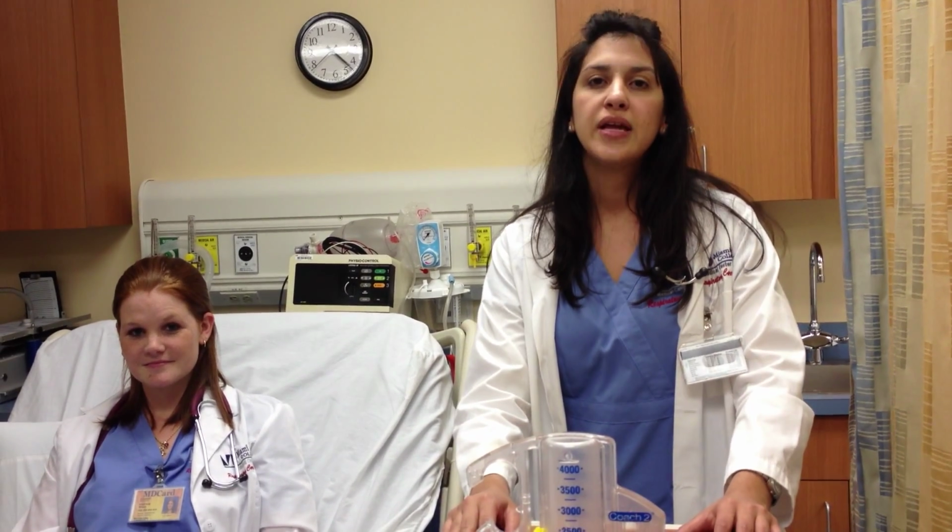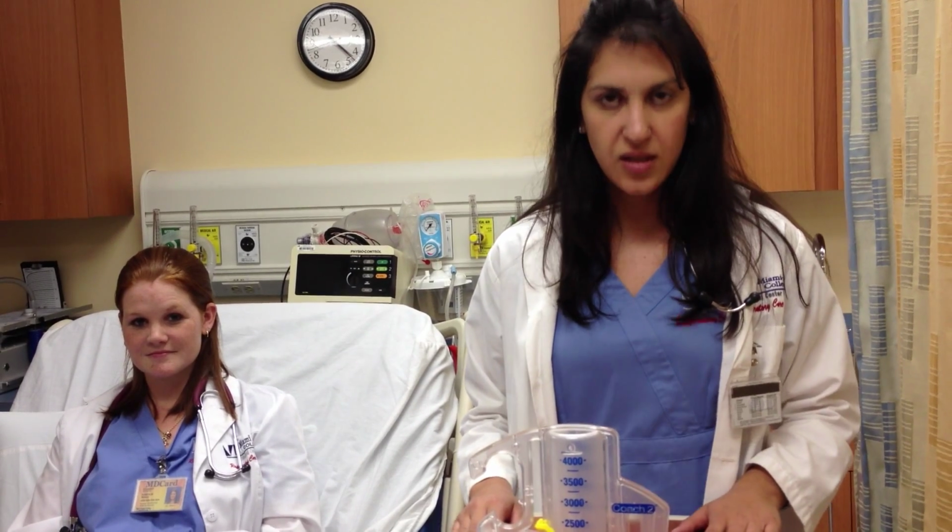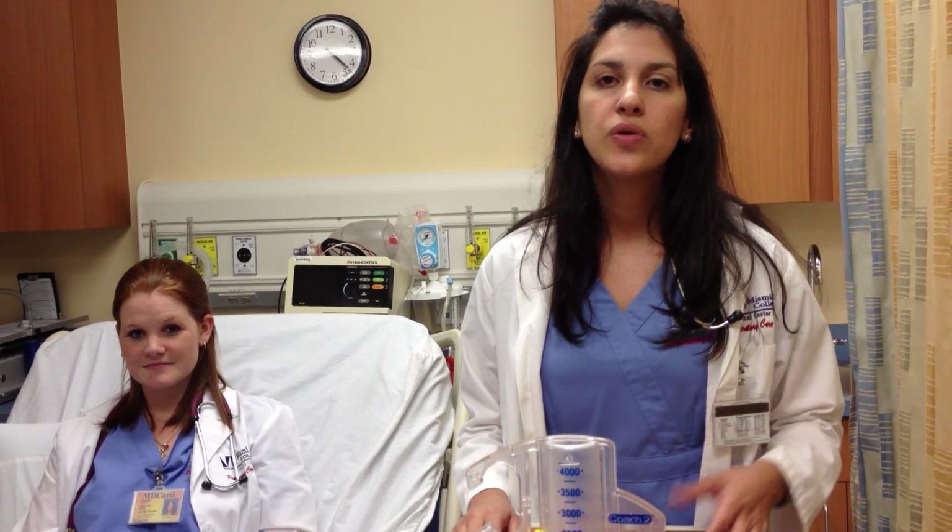I'm a respiratory therapist student at Miami-Dade College, and I'm here to explain and demonstrate the use of a breathing device called incentive spirometry. But first, you need to review your chart for significant data. Significant data includes indications for the use of this incentive spirometry. Indications include patients that are more prone to develop atelectasis.